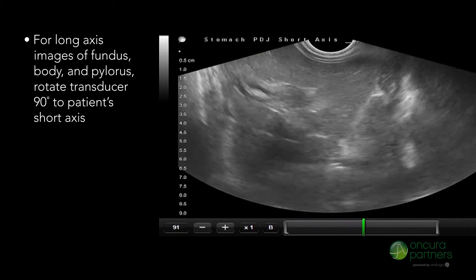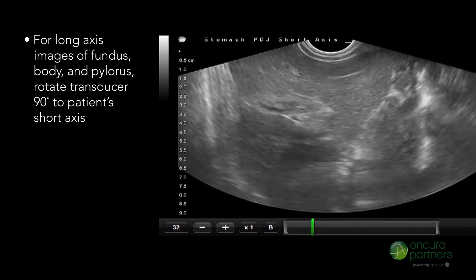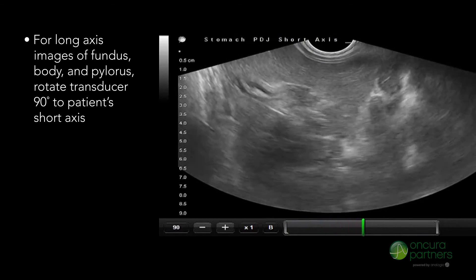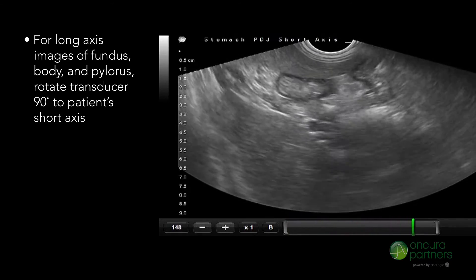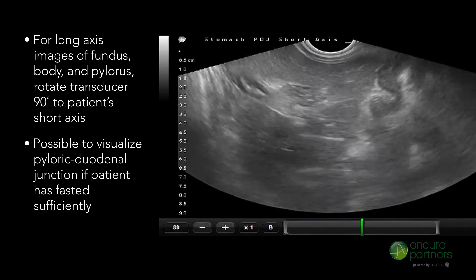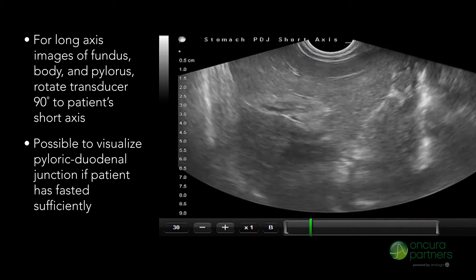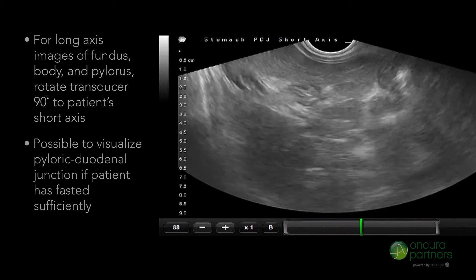To obtain long axis images of the fundus, body, and pylorus, rotate the transducer 90 degrees to the patient's short axis. In this orientation, it will be possible to visualize the pyloric-duodenal junction, granted the patient has fasted sufficiently.